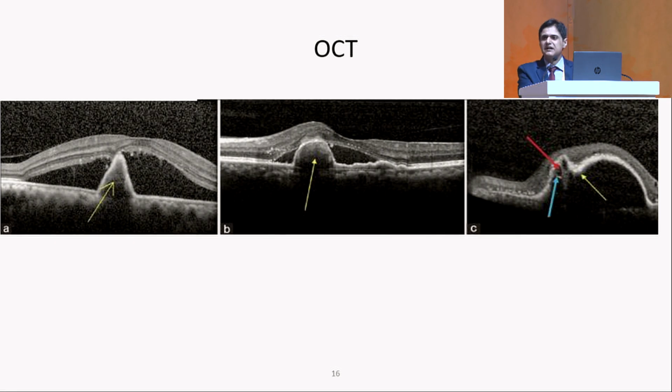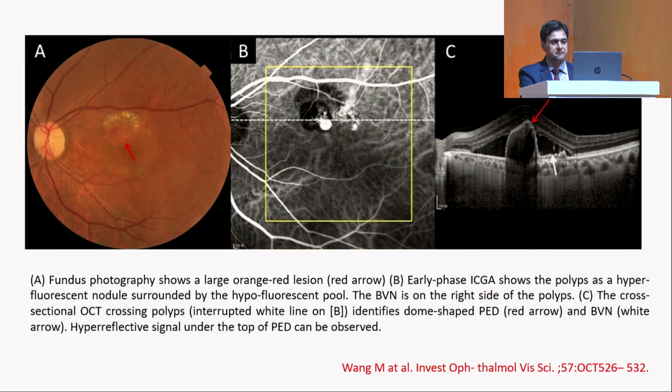So these are some classical signs on OCT which give around 80% specificity and sensitivity, and which show that there is probably a PCV lesion present. These are tall PEDs, thumb PEDs, large PEDs, notched PEDs. They are usually associated with a polyp which is present at the edge of the PED or just underneath the PED.